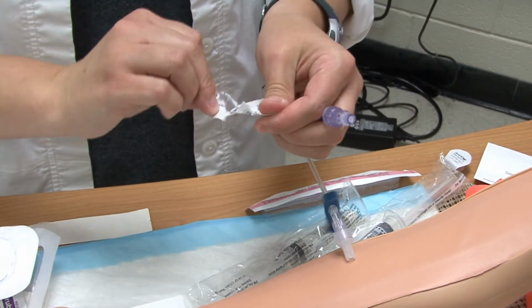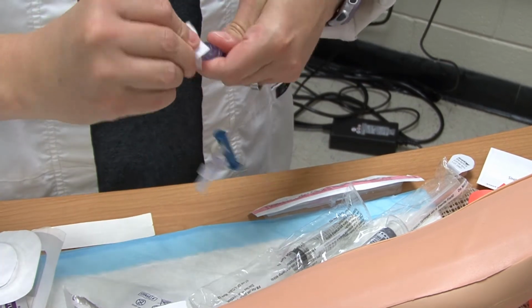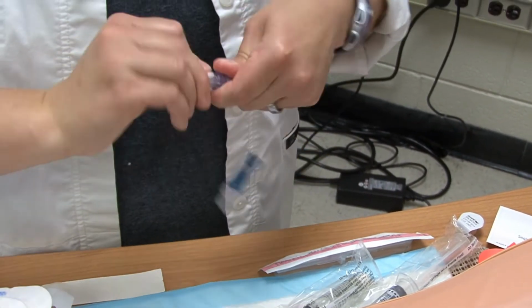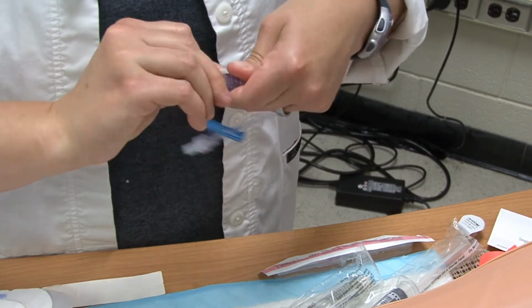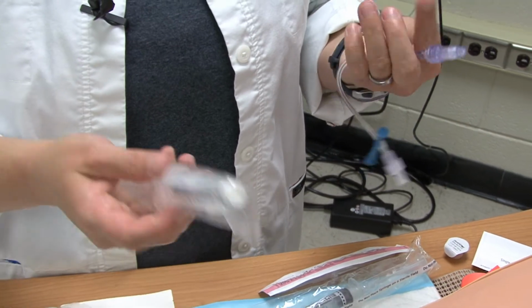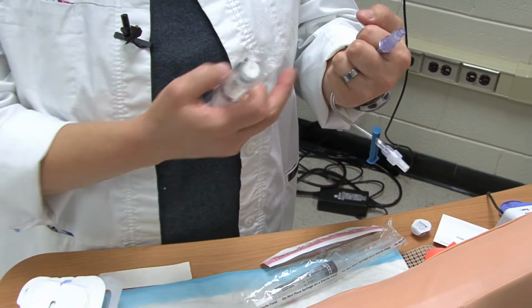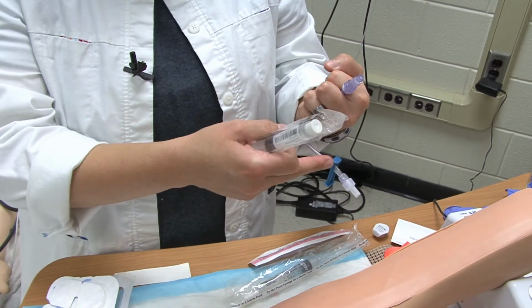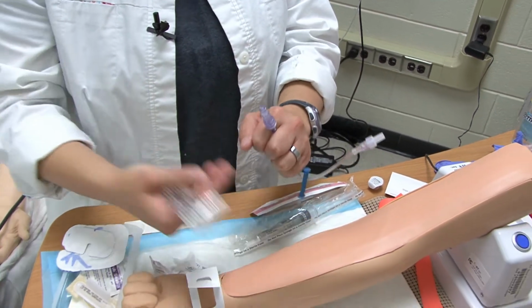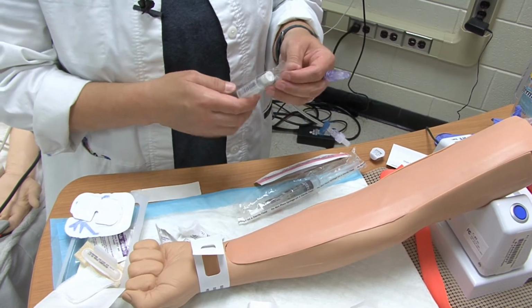So I'm going to go ahead and take an alcohol swab here, and I need to make sure that I swab it for at least 30 seconds. And we're going to say it has been 30 seconds. And once I'm done with this, then I can come back over here and I can take my actual saline flush, and I need to flush this so that it is prepared, because otherwise if I attach this piece to my patient's IV, I'm going to be flushing air into my patient, and I don't want to do that.